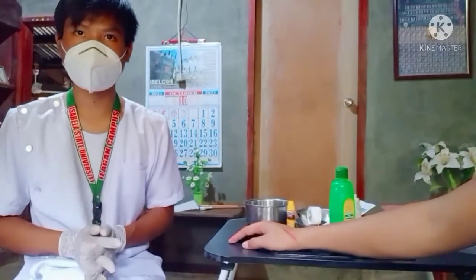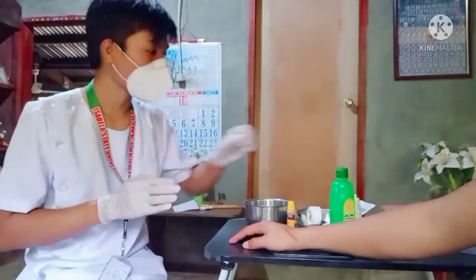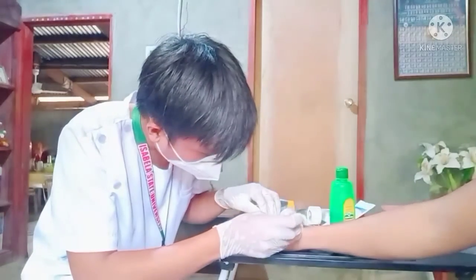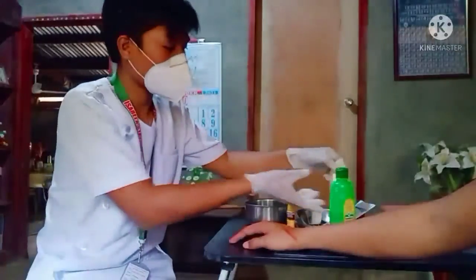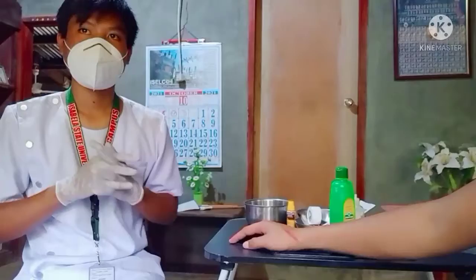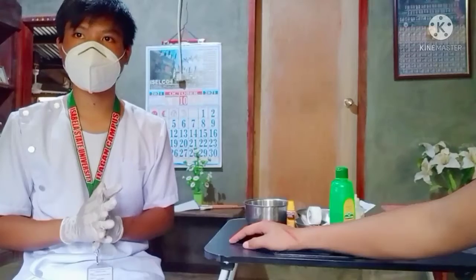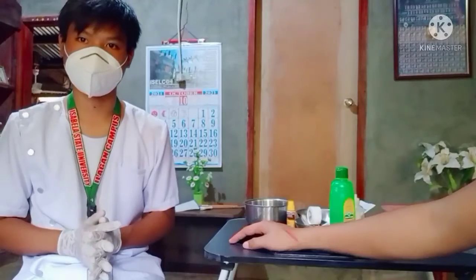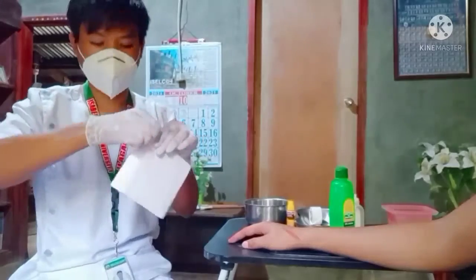Apply the ordered ointment. Use sterile applicators or tongue blades to apply ointment. And now I already put the ointment on the wound. Place the gauze pads or packing tape in the wound. Carefully fill in the wound and any spaces under the skin. This is the sterile glove swabs.